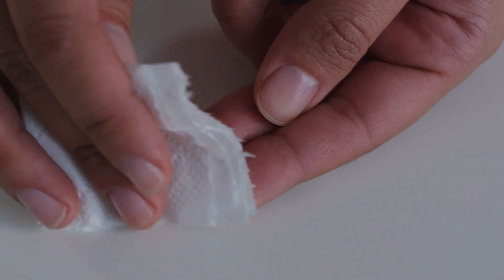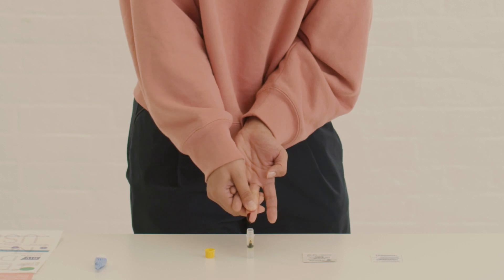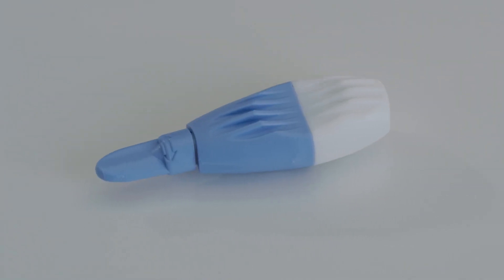Wipe away the first drop of blood with a clean tissue. Gently massage your finger from the knuckle to the tip and allow the drops of blood to fall into the tube. It's important that you fill the tube to the 600 line — this usually takes about 16 drops. If you struggle to get enough blood, you can use another lancet to repeat with another finger.